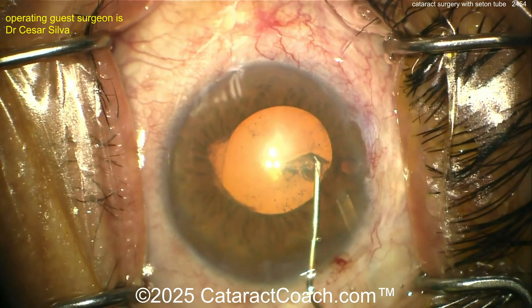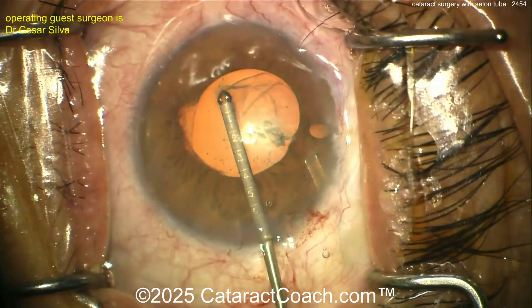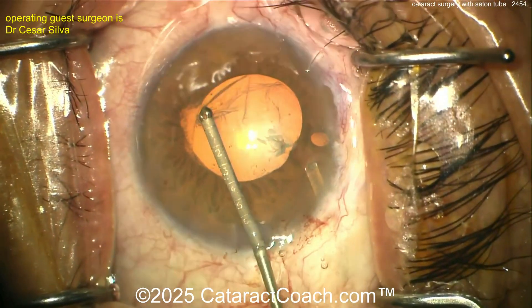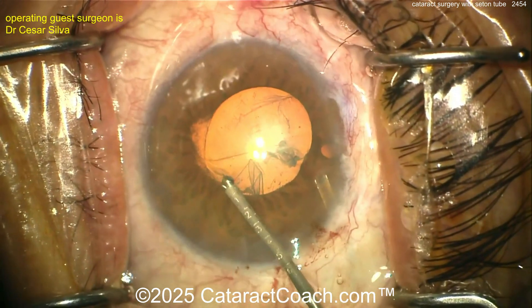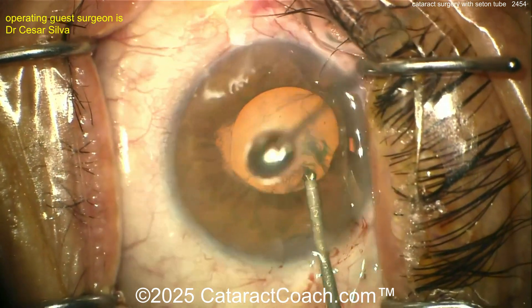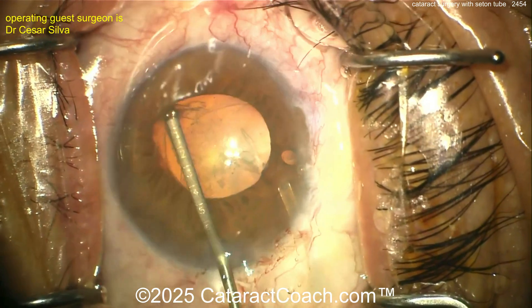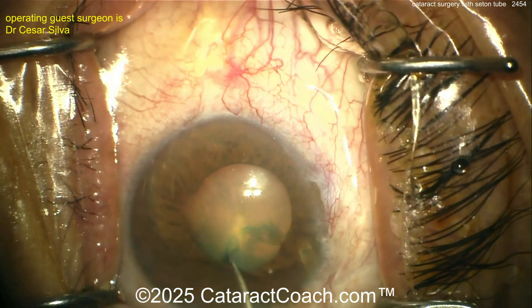Now starting off with the rhexis and getting it flipped over — very good. You want a good size rhexis; I want at least a five-millimeter rhexis here. The patient may get synechiae in the post-op period — synechiae is likely to happen with the iris sticking to the anterior lens capsule — but the iris is probably not going to stick to the surface of your hydrophobic acrylic IOL. Now the rhexis has been completed.